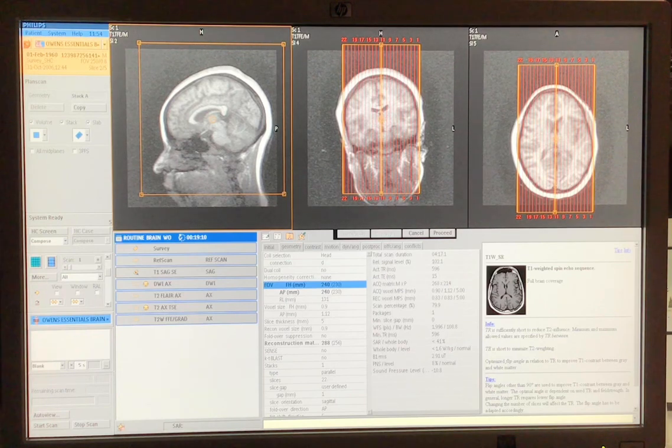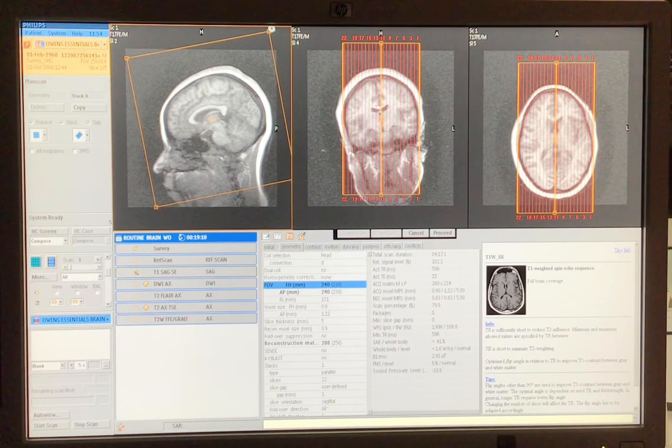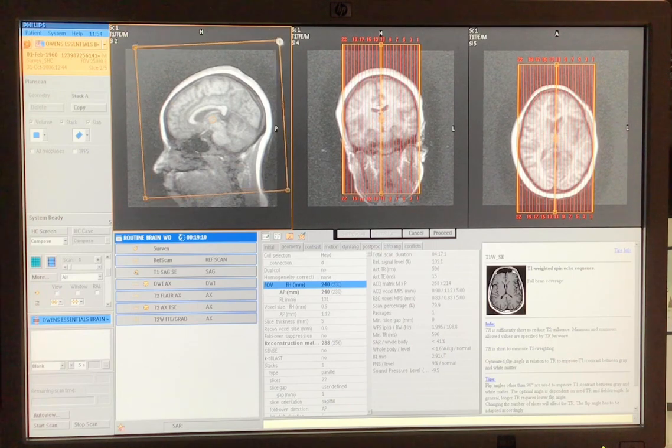So, you know, sometimes you're going to just let it straight. Sometimes you might want to angle a little bit. And then what happens is this particular head, this picture will be slanted this way for the doctors to look at. So hopefully you understand that. But for you guys, we're going to let it straight, okay?